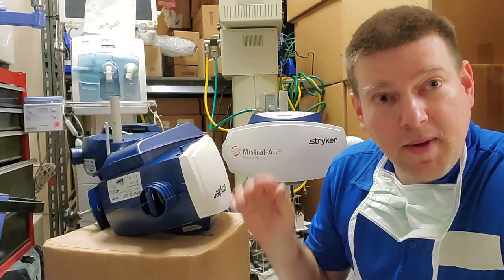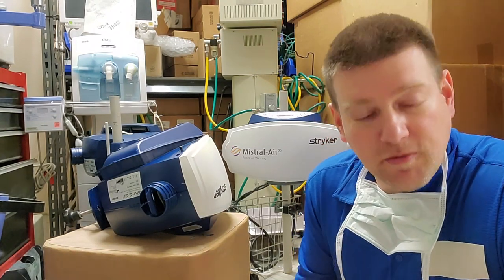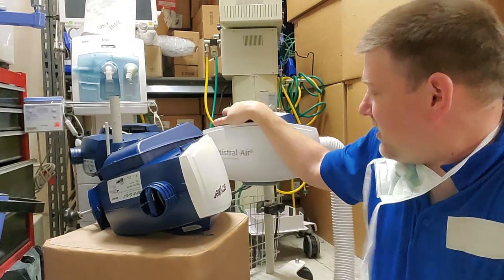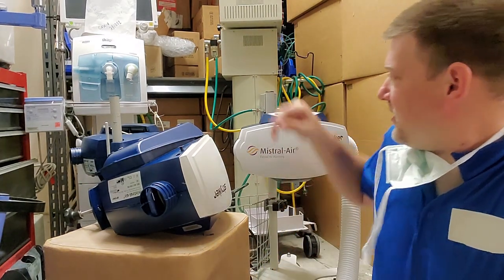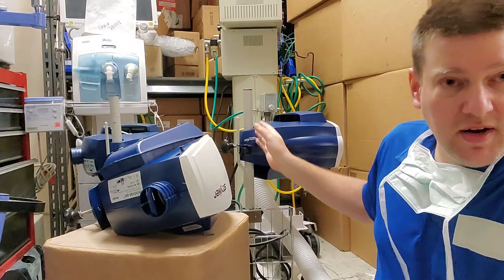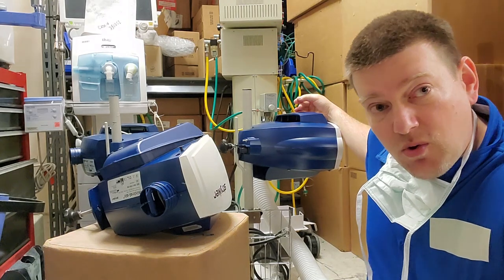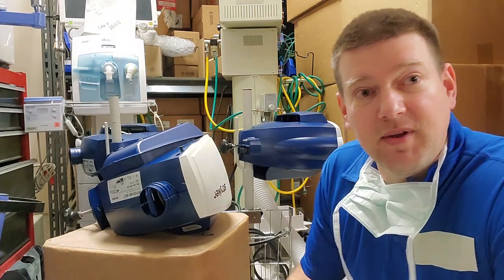This one here is what my hospital uses — it's called the Mistral Air, and it's got some pluses and minuses like all of them do. As you can see I have a few of them stacked up around my shop because they're due for repair. One of the major things that goes wrong is it has a plastic mounting system that goes on an IV pole. It's got a big front end where people like to set things on it, or they raise or lower the patient bed and it crushes them — which is why I have a whole bunch of them here.